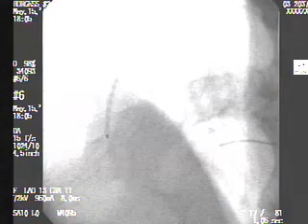Now, we have the impression that this stent, which has only been expanded probably to a little bit above 3 millimeters based on the delivery system that it was put in with, we probably need to expand a little bit bigger. Do you agree with that, Bill? I totally agree, especially with the IVUS measurements.